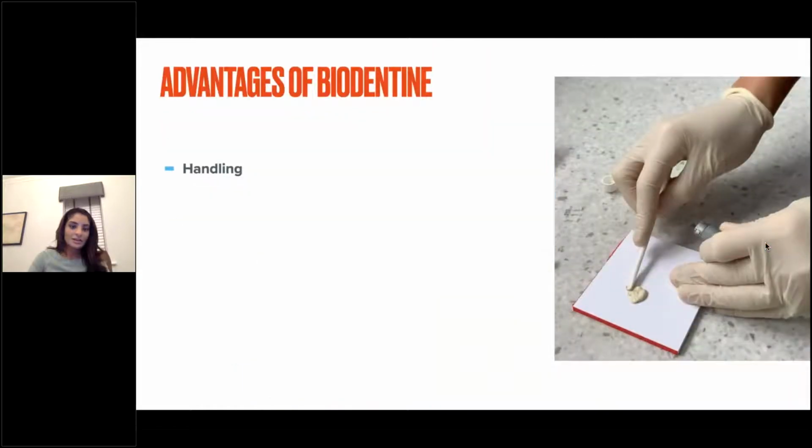Okay, lovely. So talking about the advantages now of biodentine, the first thing is it's got good handling. So it's much better than MTA, which is a difficult one to mix and also to handle. You can see that with the consistency that we see here, it's got a good handling capacity.